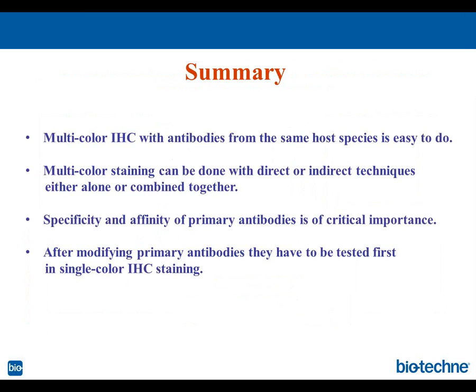Sometimes when you look at tissue stained with antibodies conjugated to fluorescent dyes, you may see this non-specific staining on top of your specific staining, and it is not going to fade. If you want to keep your tissue for a long time, it's not going to be gone. So there are several solutions you can try. There are several reagents that can be used.